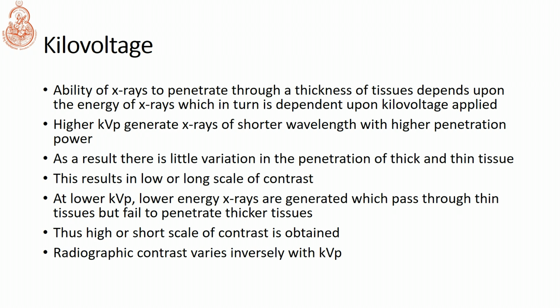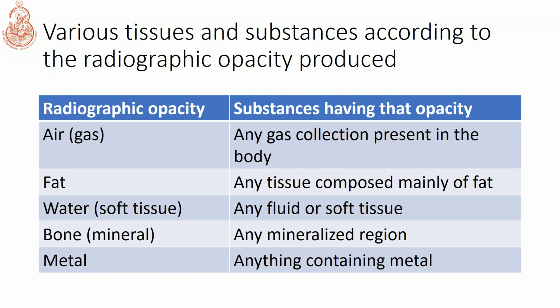This results in low or long scale of contrast. At lower kVp, the lower energy X-rays are generated, which pass through thin tissues but fail to penetrate the thicker tissues. Thus, high and short scale contrast is obtained, and the radiographic contrast varies inversely with the kilovoltage.